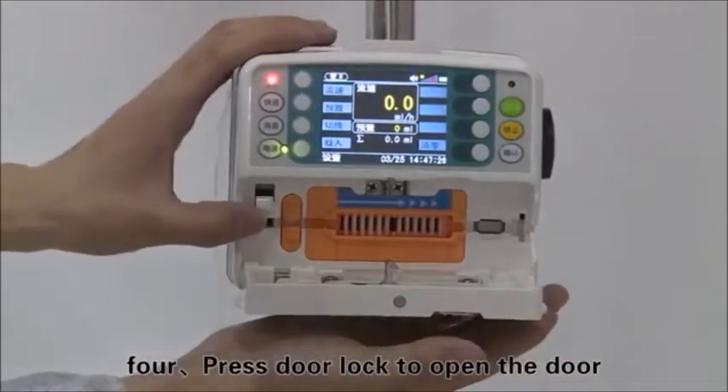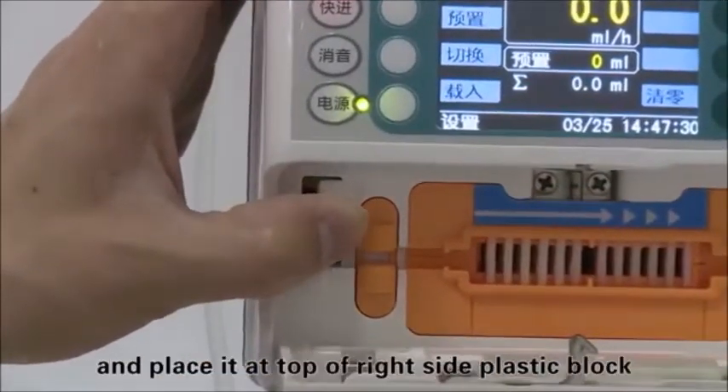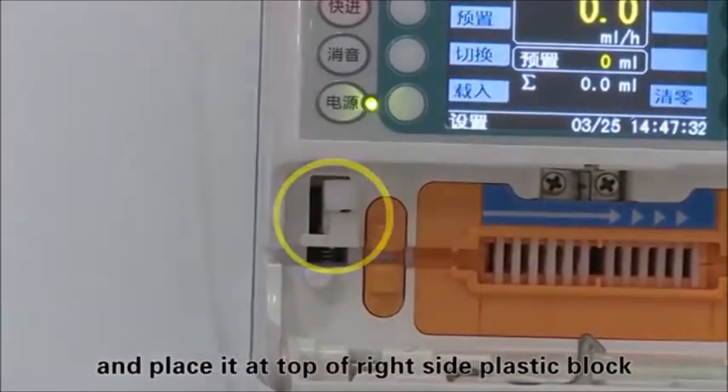Press the door lock to open the door. Raise the anti-free flow clamp upward and place it at the top of the right side plastic block.